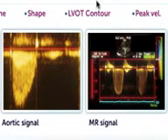Usually also, in severe aortic stenosis, you have a more dense signal. And furthermore, you can frequently see the LVOT Doppler signal in the contour here in the Doppler spectrum of the aortic stenosis signal.